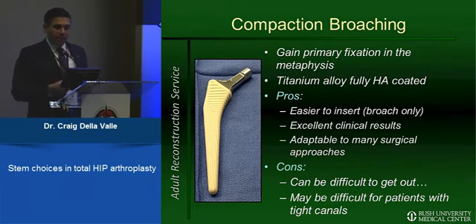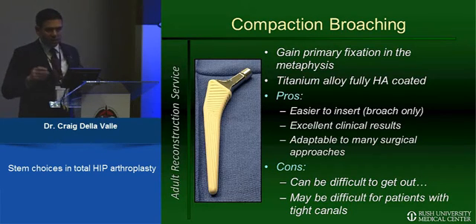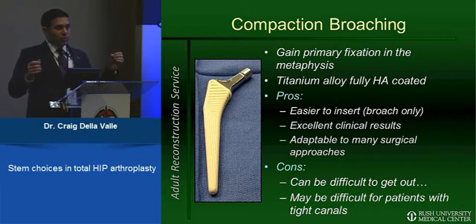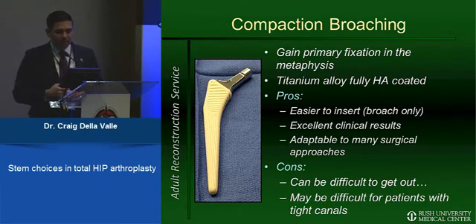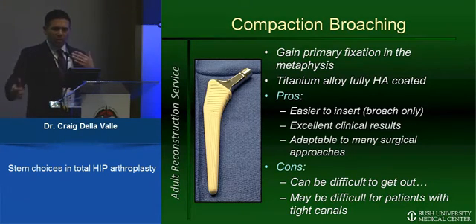Next, I just wanted to touch on compaction broaching, which, like the direct anterior, is kind of hot right now, as Karsten had said. And I think the two are kind of linked, because a lot of surgeons who do the direct anterior like to use this type of stem. Primary fixation is in the metaphysis, although it does get some diaphyseal fixation as well.